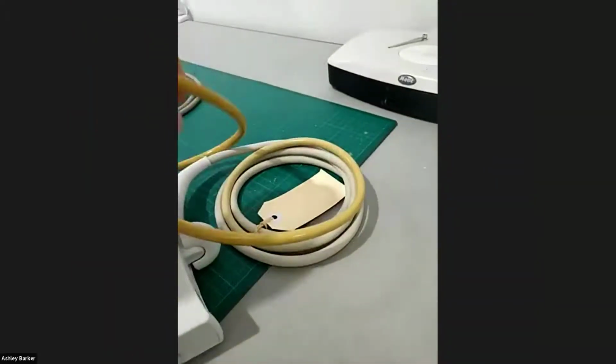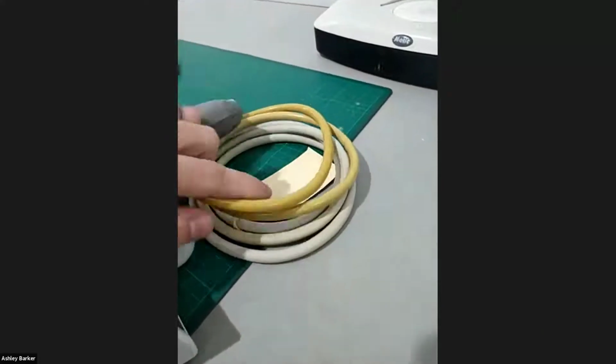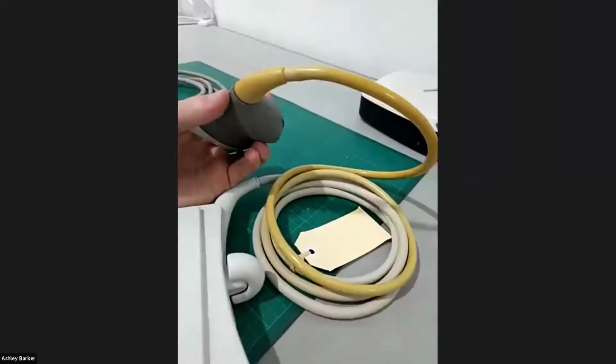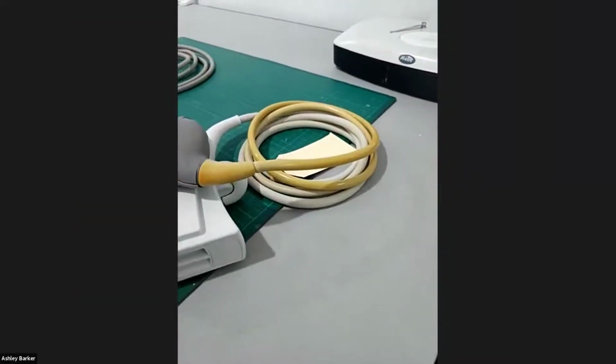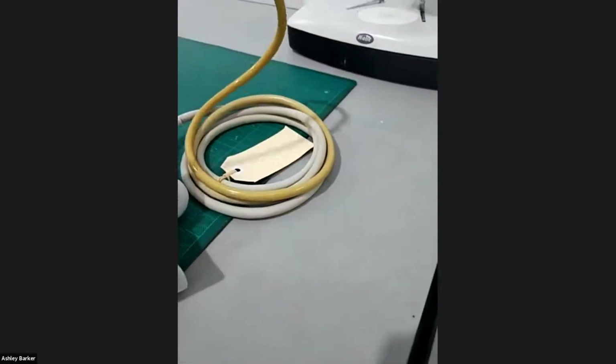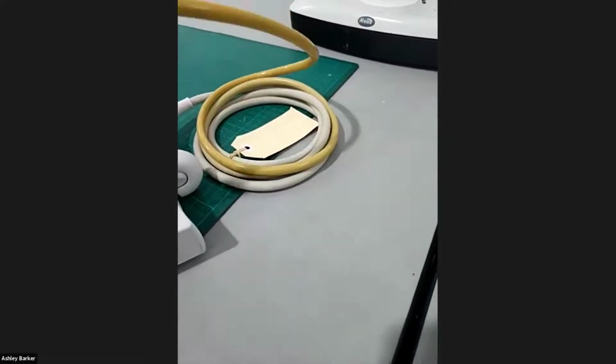Even, but then it slowly sort of gradients off as you go down the actual cable. But yeah, it's pretty even when you look at an individual point. But I mean, maybe it is years' worth of betadine. Yeah. So could maybe be some solution that they're dunking it in that way. It's more in a distal part of the cord rather than the proximal part of the cord. Yeah, the main reason I wanted to show it was I kind of thought someone might go, oh, that's the same color as some sterilization solution we use or something like that. And I thought, it's just such a common one we see. So it'd be nice to get to the bottom of.